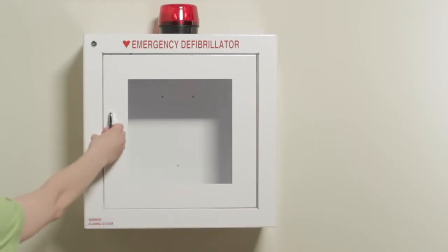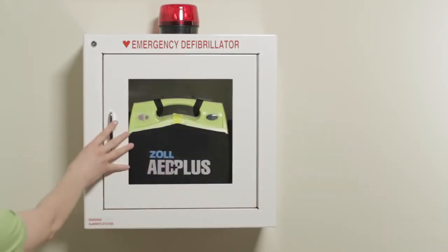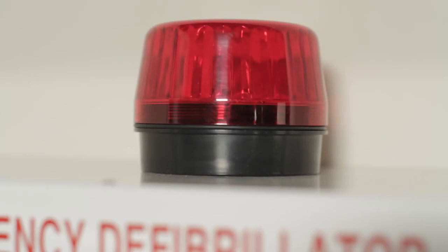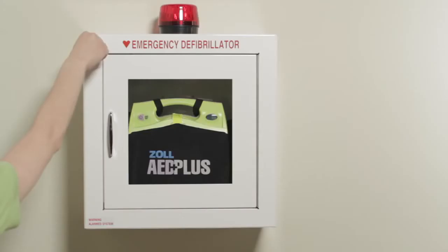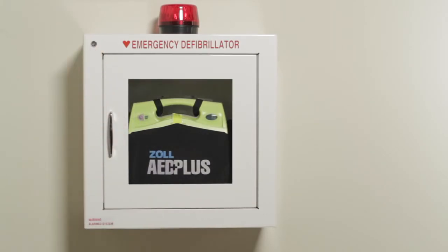If you keep your AED Plus in a wall cabinet, place it along with any backup pads into the cabinet. The key does not lock the case. It turns the door alarm on and off, so that when anyone opens the door, the alarm will go on and stay on until the door is closed again. When you want to inspect and test your AED Plus, you can use this key to turn the alarm off and open the door without sounding the alarm. When the inspection is complete, you can turn the alarm on again.